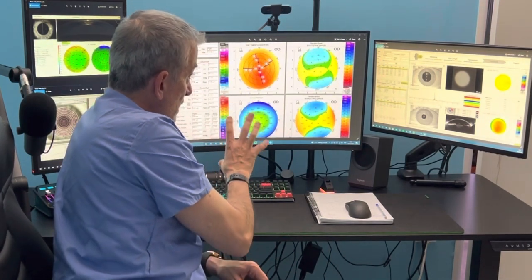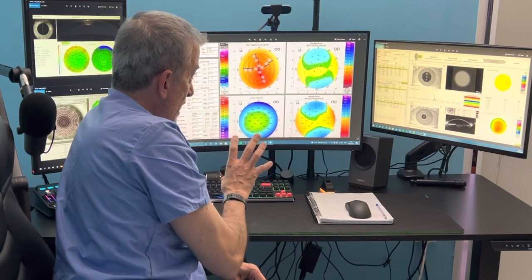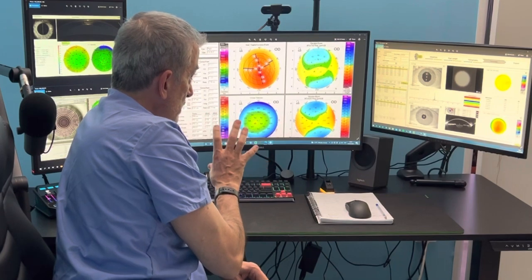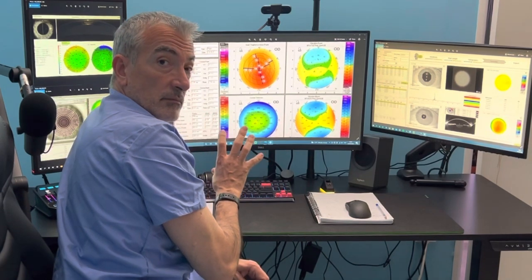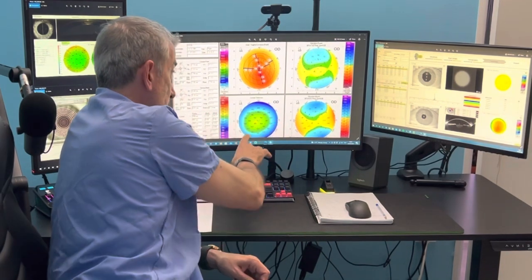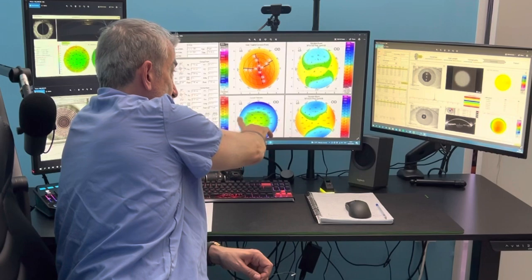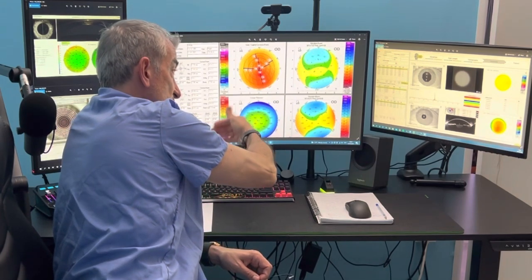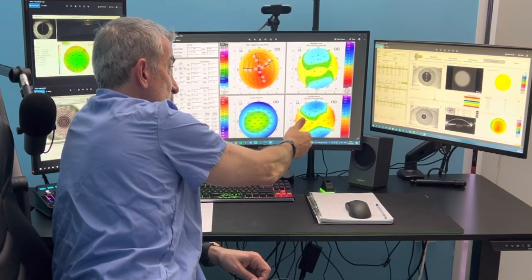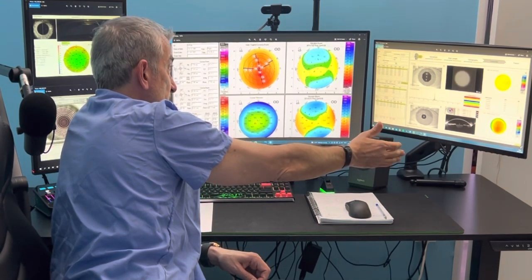These Pentacam maps are not perfect because the pachymetry maps are skewed inferotemporally. The same thing happens on the left eye.